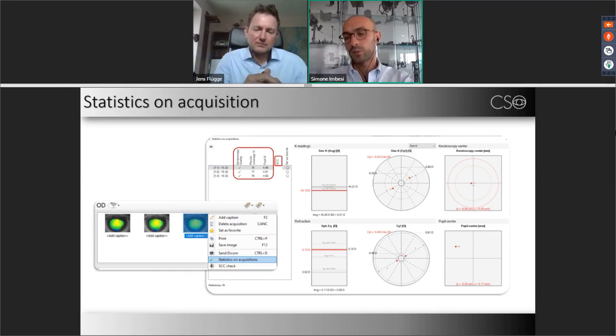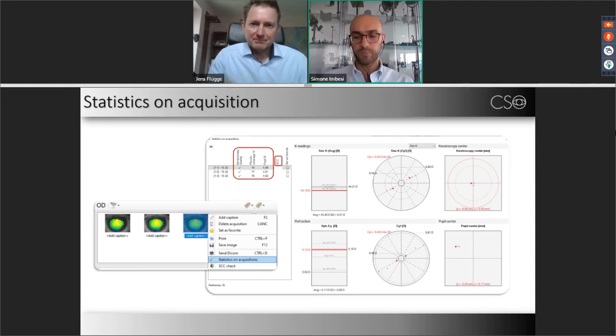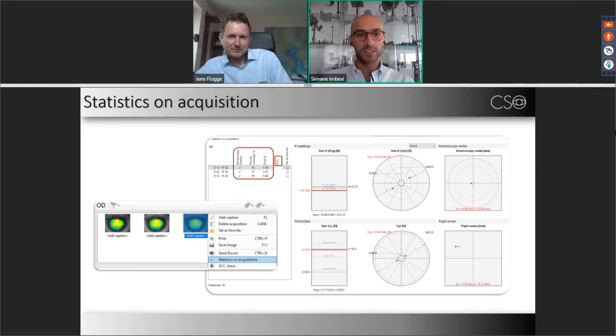Thanks to this, SCHWIND can manage which will be the correct orientation of the treatment. To get this value better, it is suggested to cover the eye without touching it, because if you touch the eye, you can compromise the opening of the contralateral eye. So it is suggested to cover the eye and ask the patient to open wide. Okay, and you will get a good SCC value.